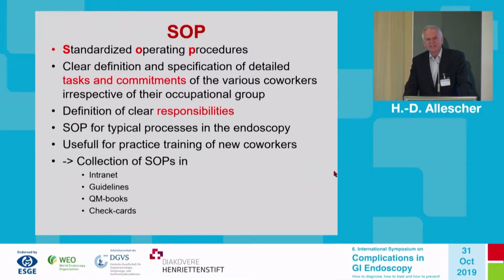So the basis for all these preventive mechanisms is that you have to think what you want to do and that you have to standardize your endoscopic procedures. That sounds simple, but everybody who has tried this realizes that it's really very difficult to give you a very standardized approach to what you're doing all day. So what you have to define is so-called SOPs. We all know this, standardized operating procedures.